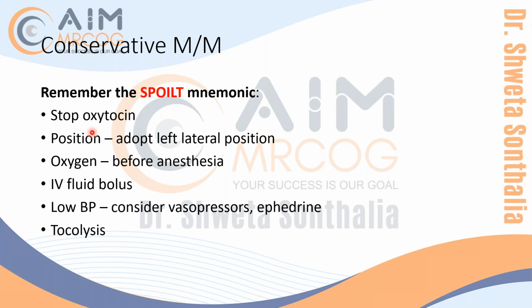So stop what you are giving for stimulation. Let the baby relax. Give the baby some time to recover, and then you can restart if needed. So stop oxytocin, and tocolysis if needed, and all this we already know. Change position, give fluid. If BP is low, give the vasopressor. So this is what the conservative measures mean in cases of pathological or suspicious CTGs.